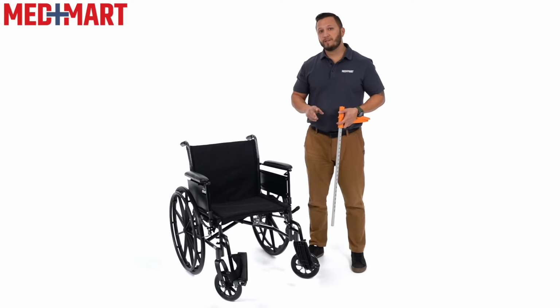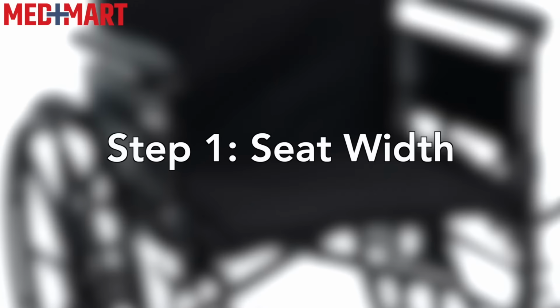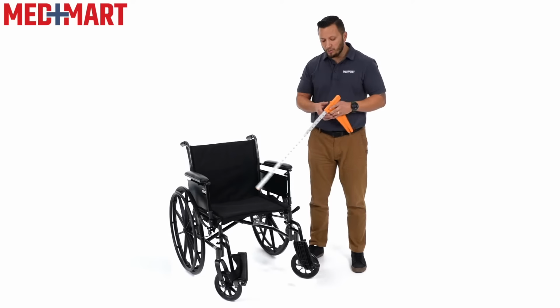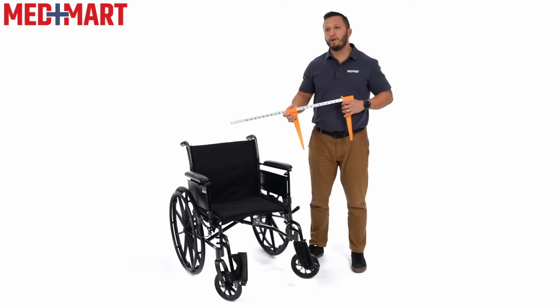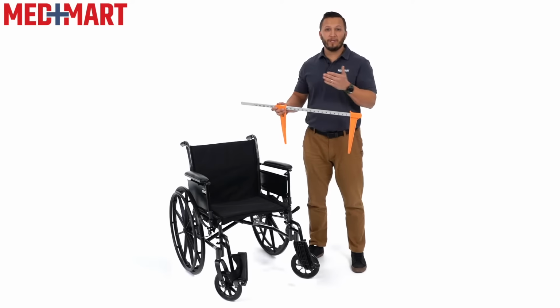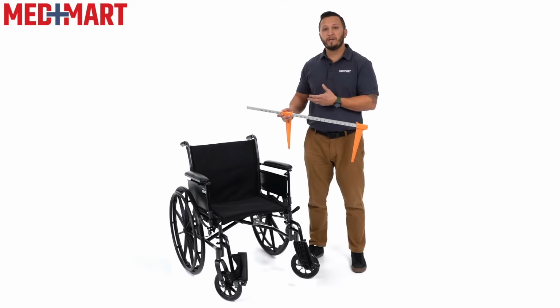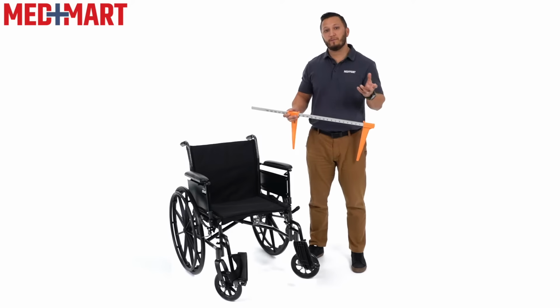There are two different ways that the size can be modified on a standard manual wheelchair. The first and most important being the hip width. So I get this question asked a lot. Do I want to measure my hips when standing or sitting? And the answer is that you want to measure your hips when you're in a seated position to figure out what size wheelchair you need, simply because your hip width might be different when you're standing versus sitting.